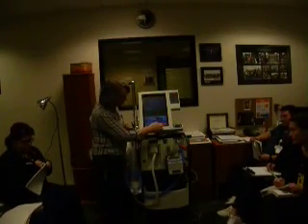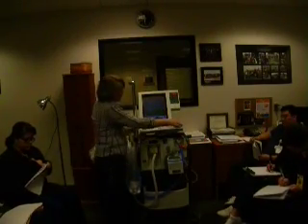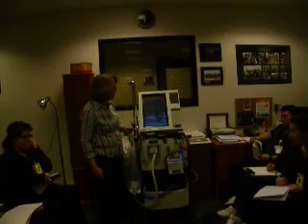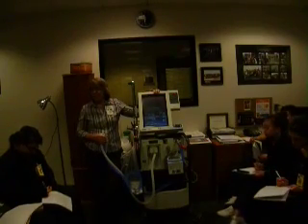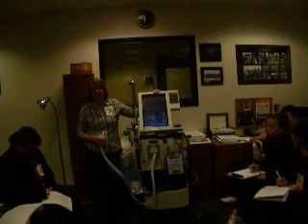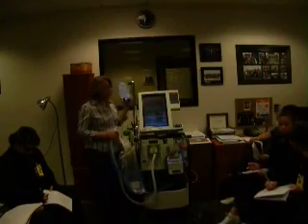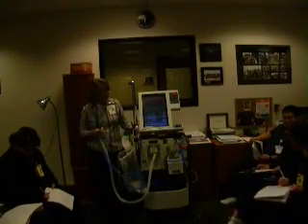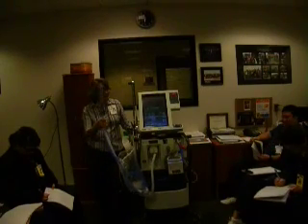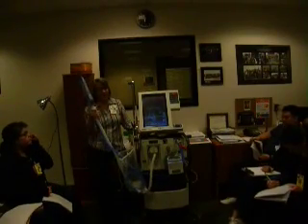Then you'll see it says use knob to adjust, to apply, press accept. So now I'm going to hit accept because I put everything here the way I want it to be. We'll just pretend that I did. So now I hit accept. Now notice the top says waiting for patient connect. I've now set my settings and confirmed them, so the ventilator is now okay with me hooking it up to my patient. Not before this time though, because in the ventilator's mind you hadn't set it. So you can't be hooking it up to a patient. So now, as soon as you hook it up, it will start ventilating all on its own. And you'll see that that goes away. It senses that the patient was hooked up.